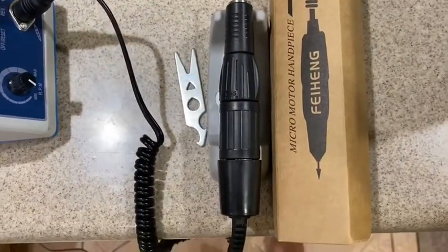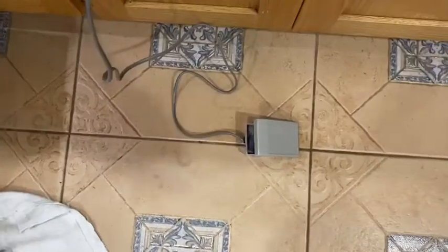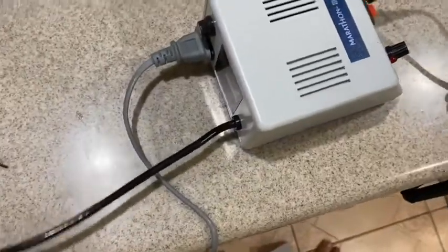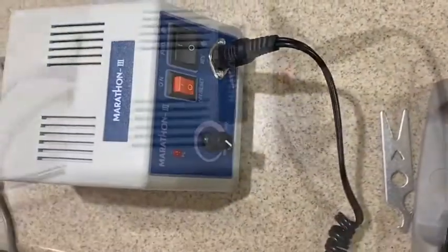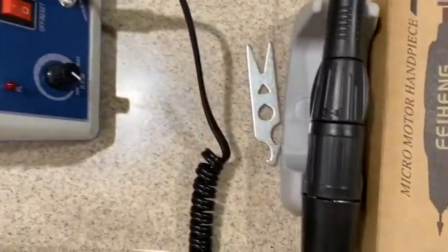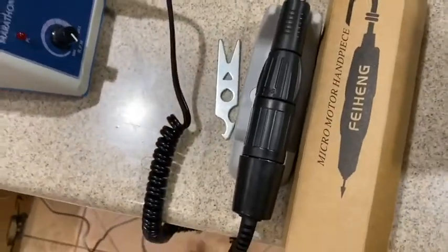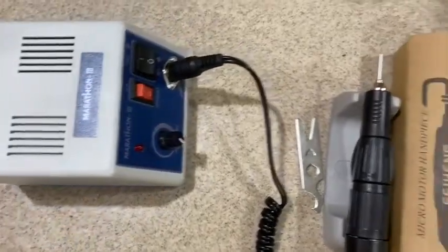You can get this from Amazon for $110, and within one week you can receive it. This is the foot pedal, and this is the electric power light — you plug it into the foot pedal. Very simple. This is something the manufacturer doesn't even provide information about.